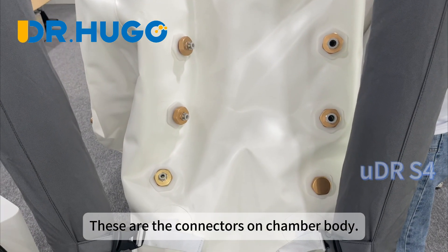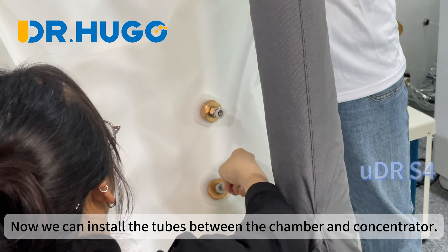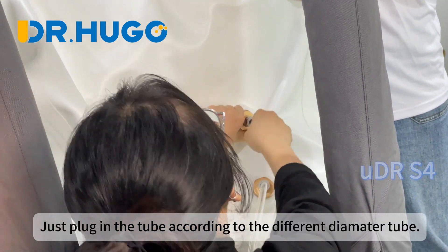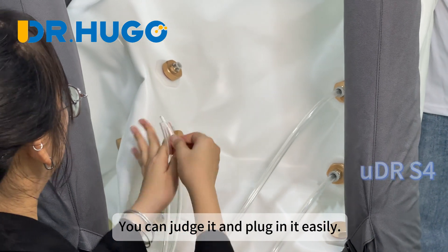These are the connectors on the chamber body. Now we can install the tubes between the chamber and concentrator. Just plug in the tube according to the different diameter tube — you can judge it and plug it in easily.